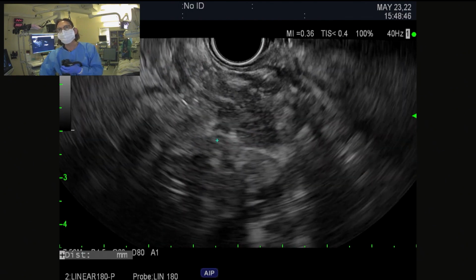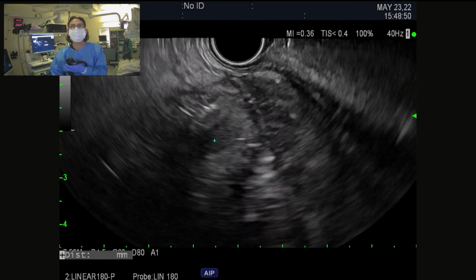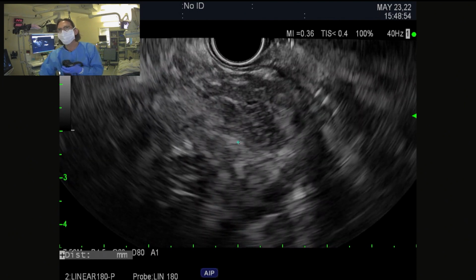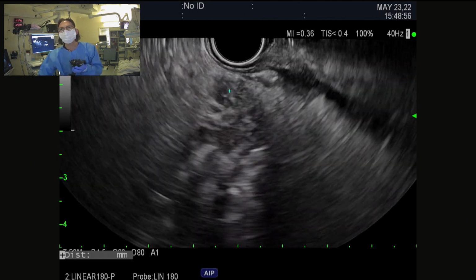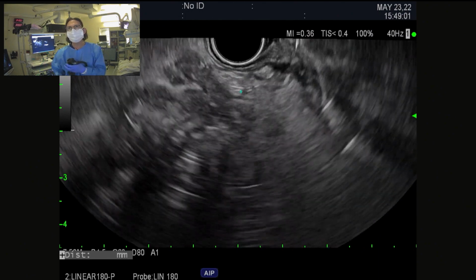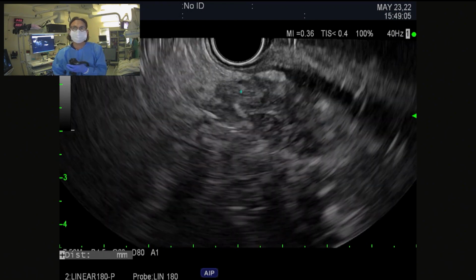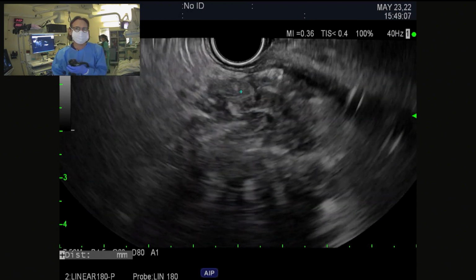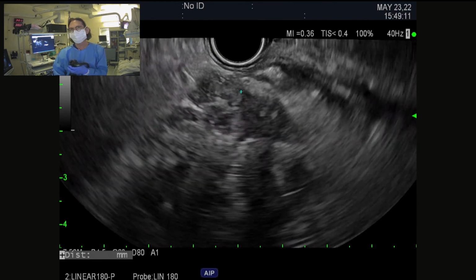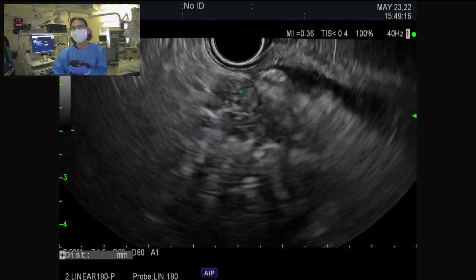Later on, it starts to have greater echogenicities inside of it. So even though this is not well demarcated, you really don't see a well demarcated wall, what we know is that this patient has an infected collection that is quite extensive, that extends right down into the pelvic gutter, and he had percutaneous drainage done, and he is sick.